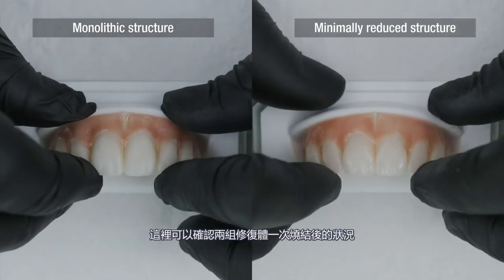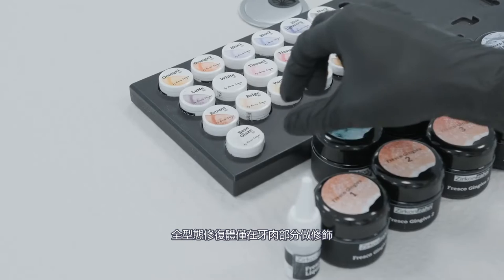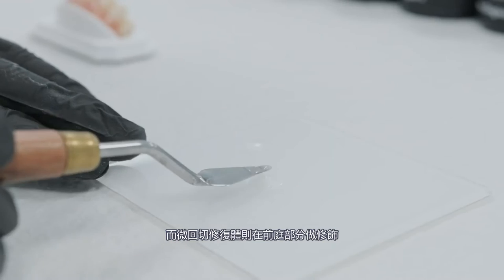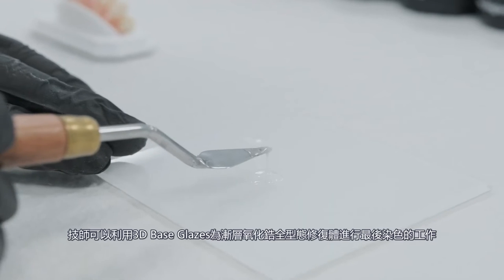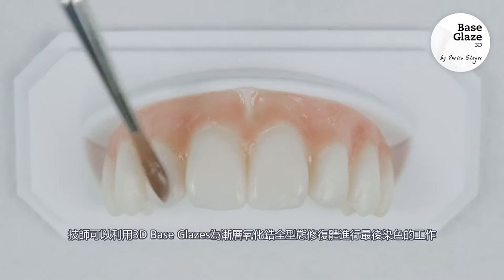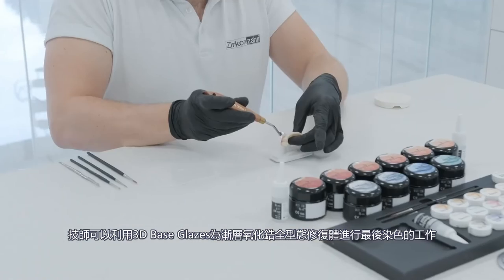Here you can see both structures after the first firing. The monolithic structure was only veneered in the gingival area, while the minimally reduced structure was also veneered in the vestibular area. For a uniform glaze, the monolithic structure is covered with 3D Base Glaze, followed by a glaze firing to give the dispersive zirconia materials their final color.